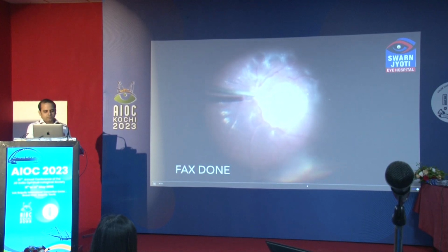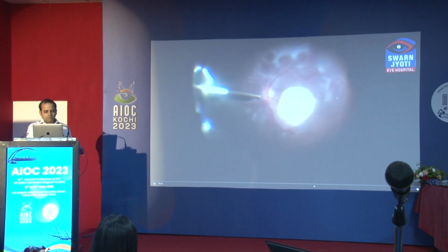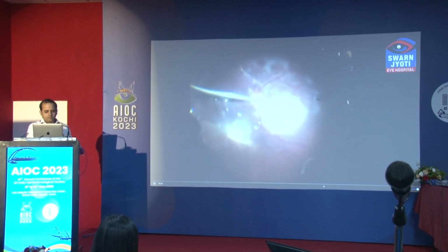Fluid air exchange was performed. The subretinal inflammatory debris and the SRF were carefully removed from the retinotomy that was made earlier.